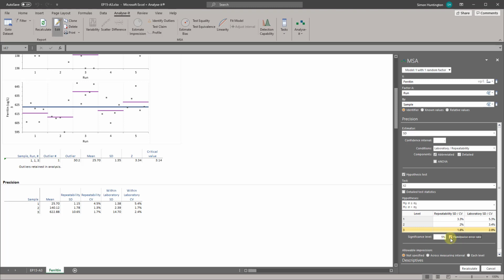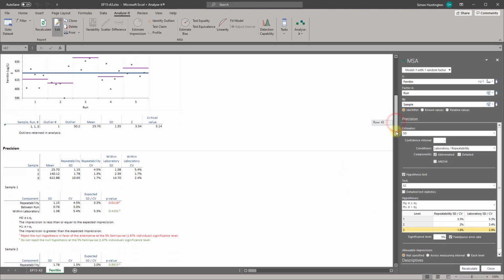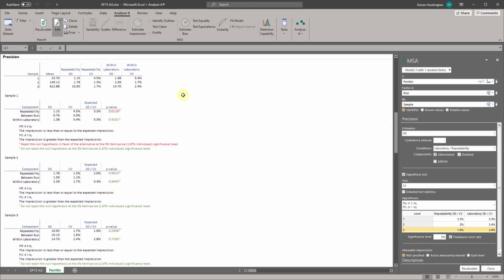CLSI EP15 uses a Family-Wise Significance Level, so the overall significance level is a maximum of 5% regardless of the number of levels tested. That's it. Just click Recalculate. Then the analysis report updates. The detailed variance components table shows the observed and expected SD or CV, along with the hypothesis test p-value for each level. All the hypothesis tests except one are not significant and highlighted green. The one significant test is highlighted in red.